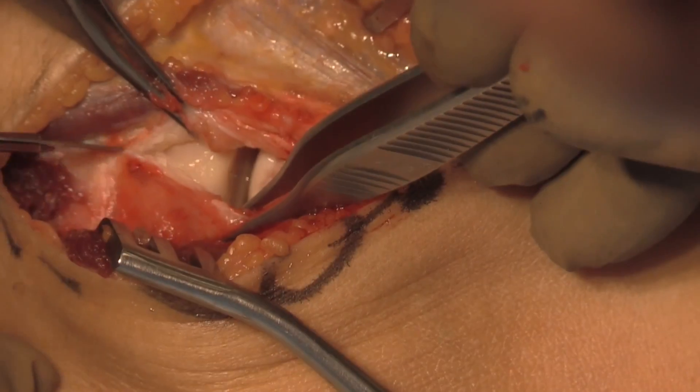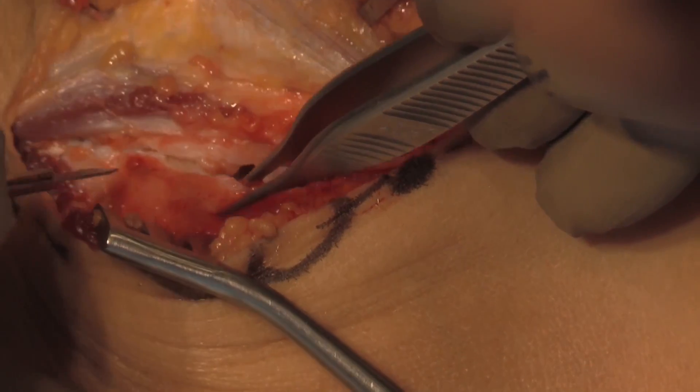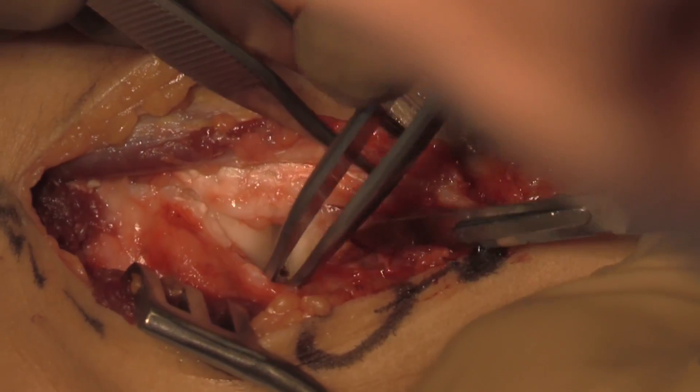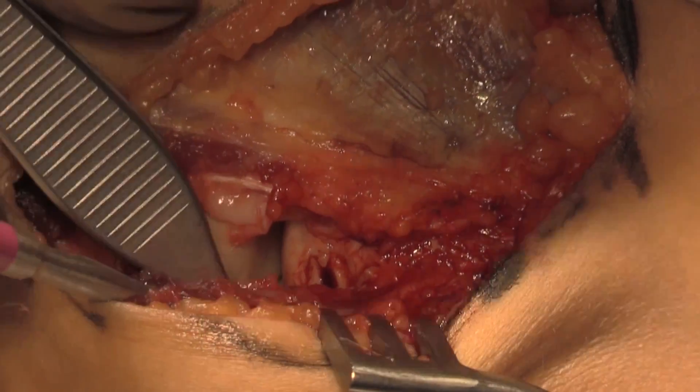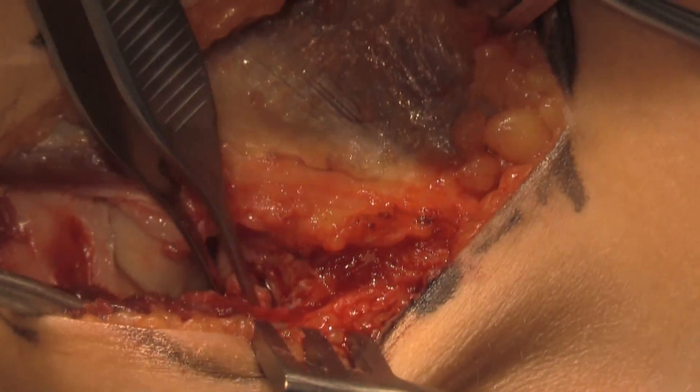Stay sutures are then placed into the capsule and the dissection is taken over the radial neck. At this point, the loose fragment that was seen on the MRI is visualized and removed.